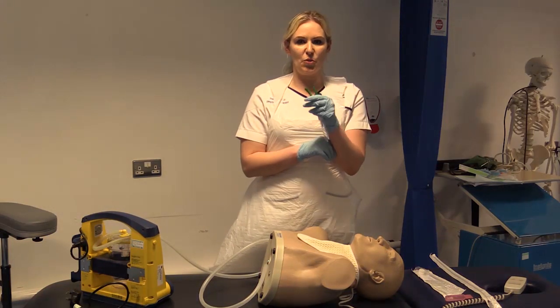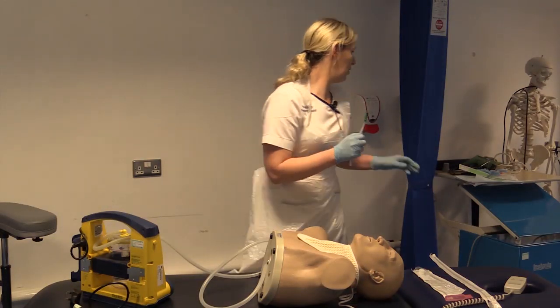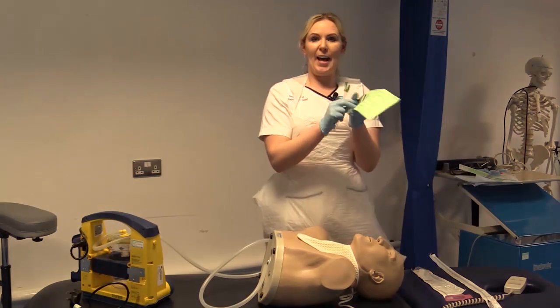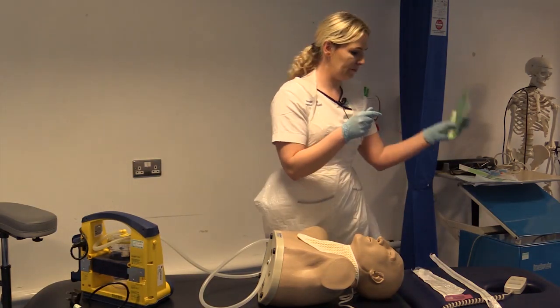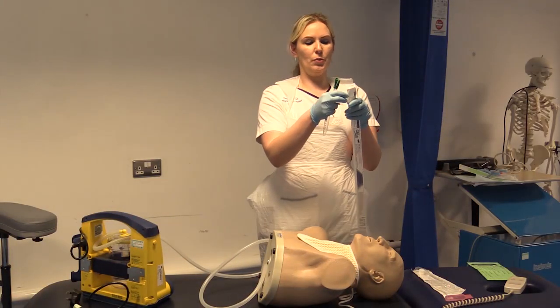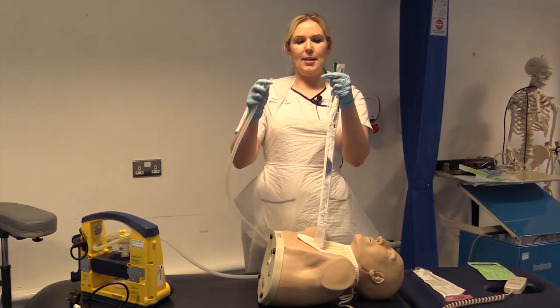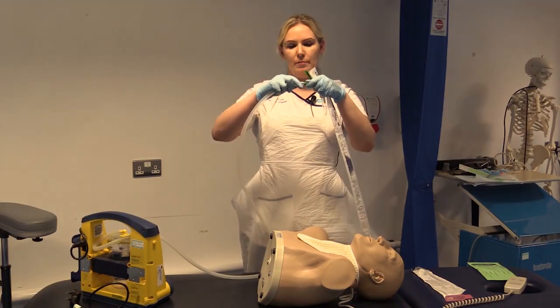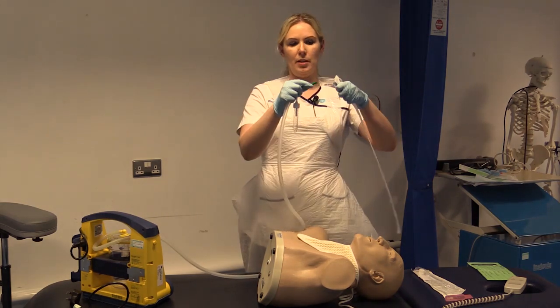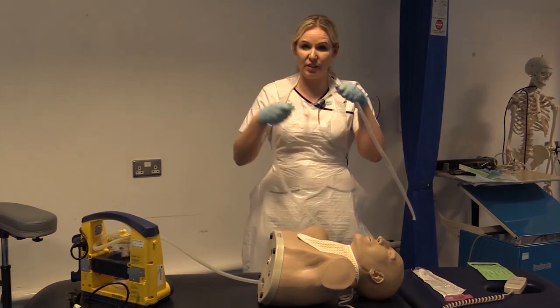So when you go into the patient's room, make sure you have all your necessary bits and pieces with you, including your sputum trap, your request form, your biohazard label, and any patient labels that you need to take in. Okay, so really there's only one way that this can go. So this end attaches into your suction tubing, okay, and this part goes to your catheter. Okay, and then you just proceed on with your normal suction.